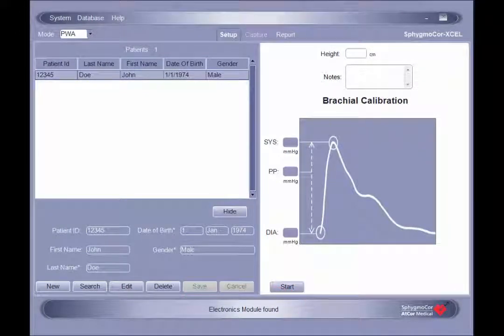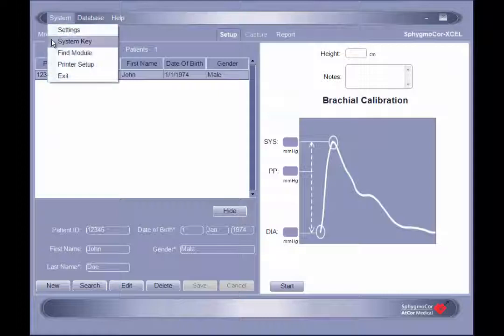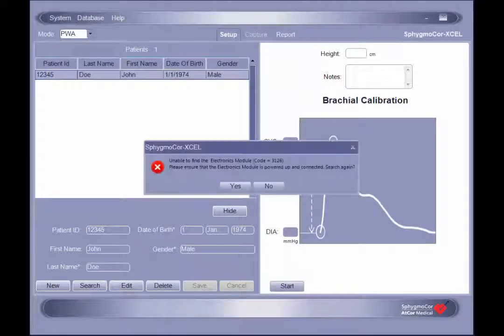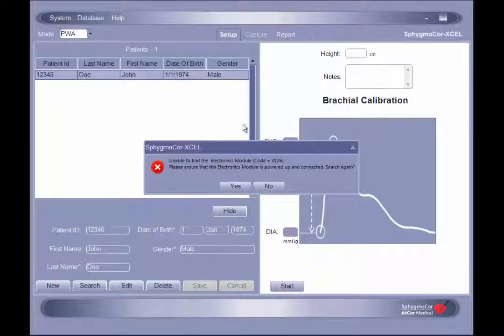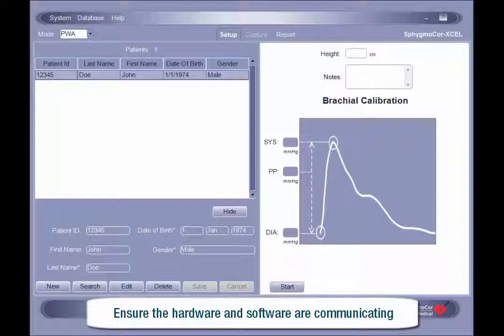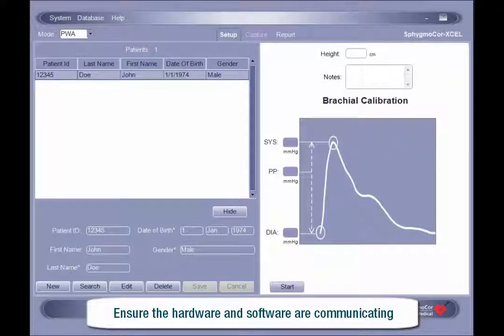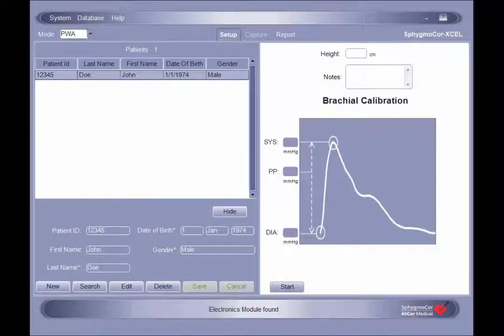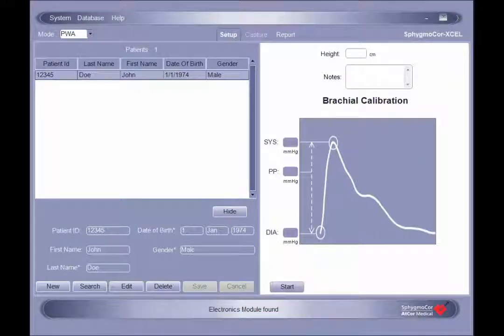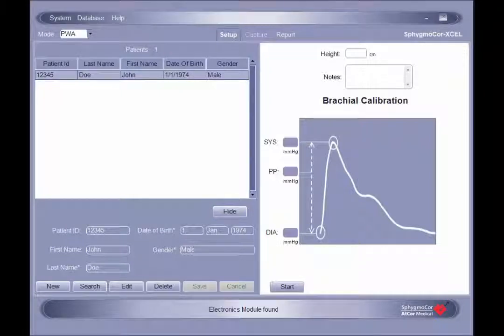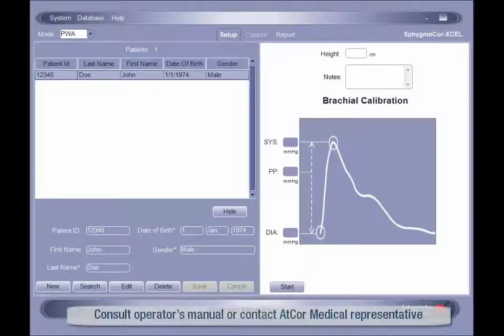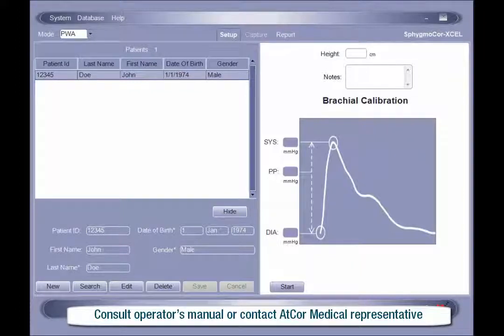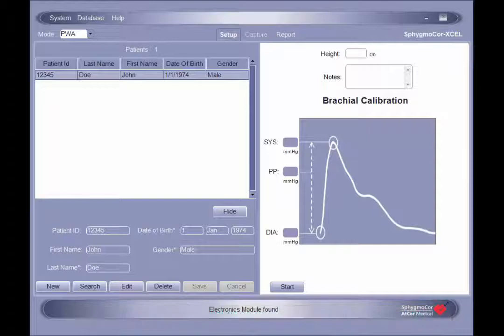If an error message appears, this indicates that communication could not be established. In this case, ensure that the USB cable is properly connected to both the module and the computer, and that the module is powered on. Once confirmed, re-attempt the Find Module function. If communication still cannot be established, consult your operator's manual for further troubleshooting suggestions, or contact an AtCore medical representative.